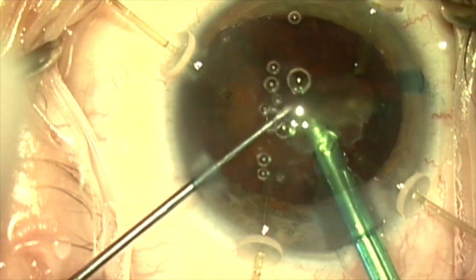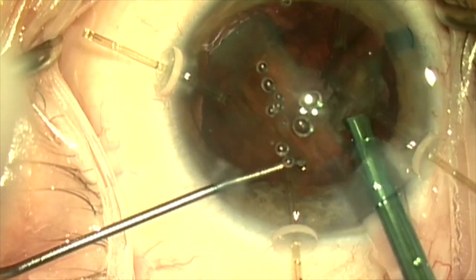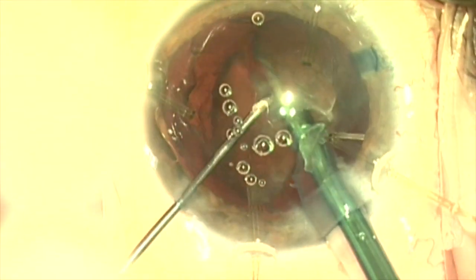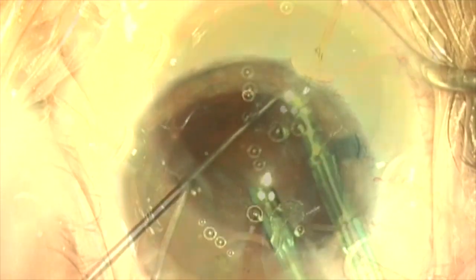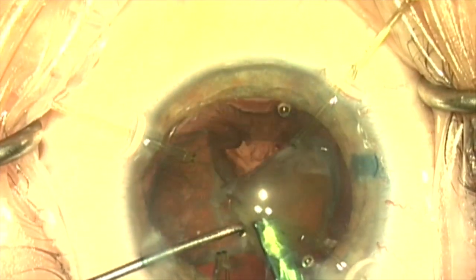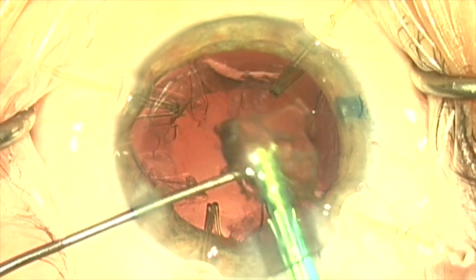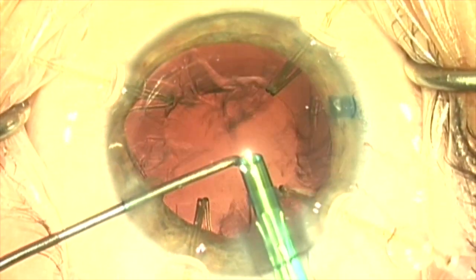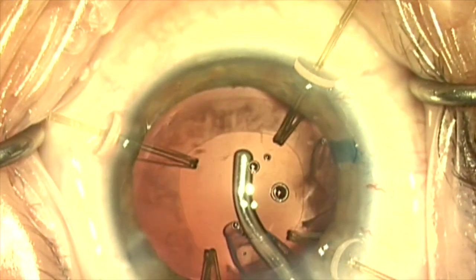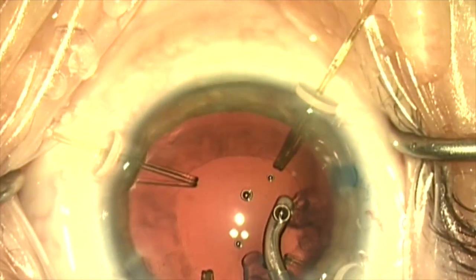We'll go ahead and take out the first quadrant. This is a Bausch and Lomb Stellaris machine with active fluidics, and I find it's quite good for these kinds of cases — very good control without a lot of flow, and the corneas look very good the next day. We're completing the phacoemulsification here, then going ahead with irrigation and aspiration. The capsule retractors are holding things in place nicely.